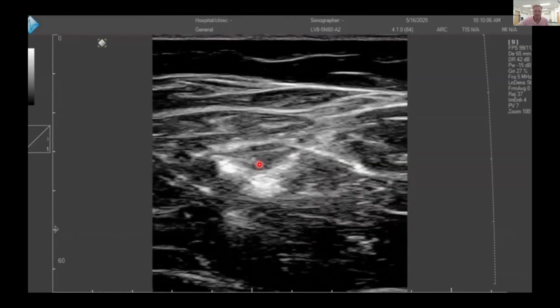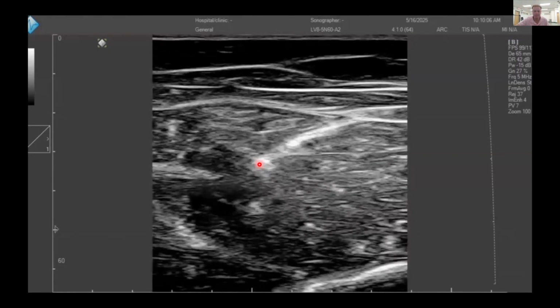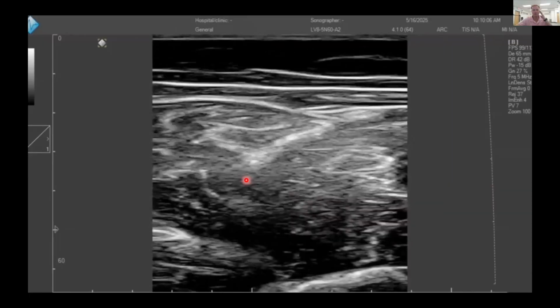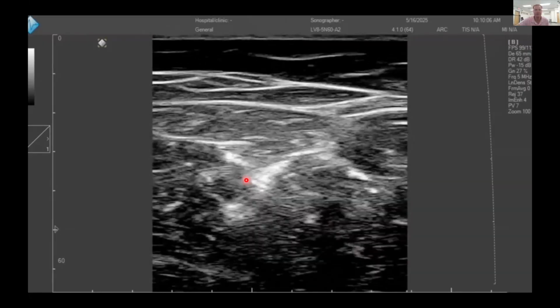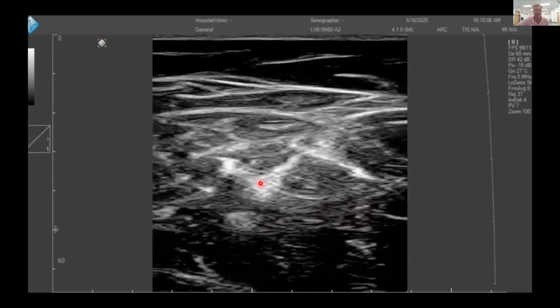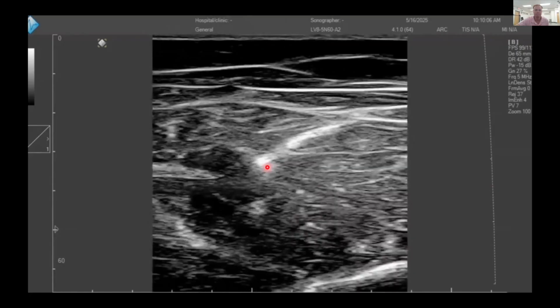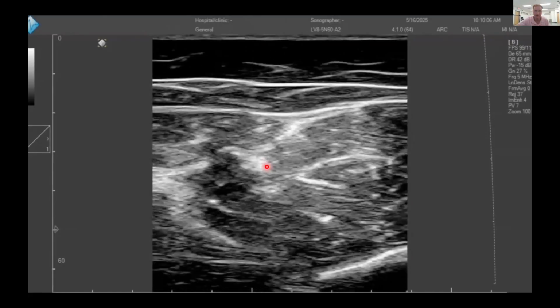It might not be as clear in some parts because of the orientation and settings of the ultrasound probe that I'm using, but right next to it, you'll also be able to see two circular dark structures as well. Again, giving away that we are looking at a nerve here. So I'll just let this play through to the end. Again, hopefully not too glitchy on your end. I'm keeping the cursor over where the nerve is. Here, this bundle of connective tissue will come in and out of image.